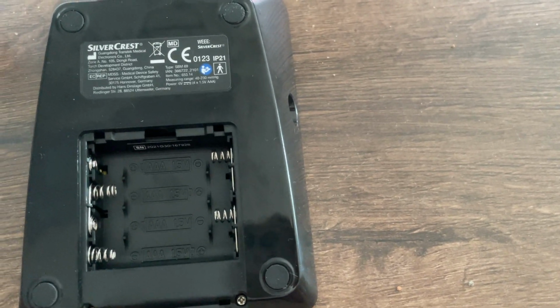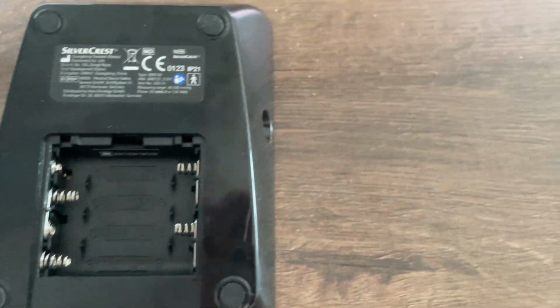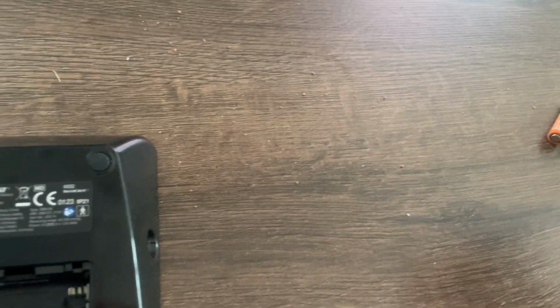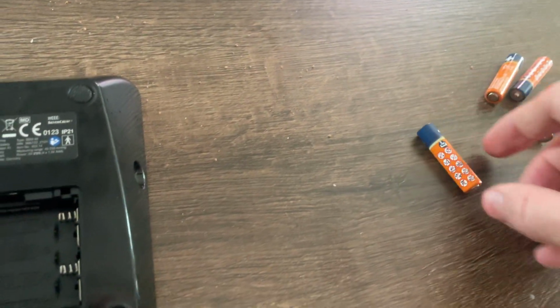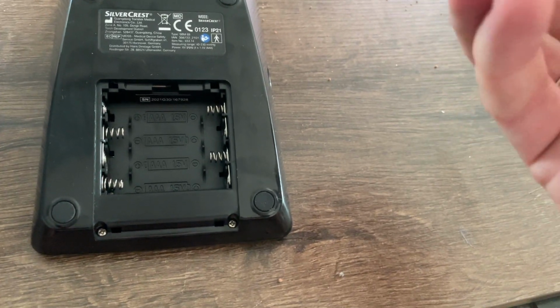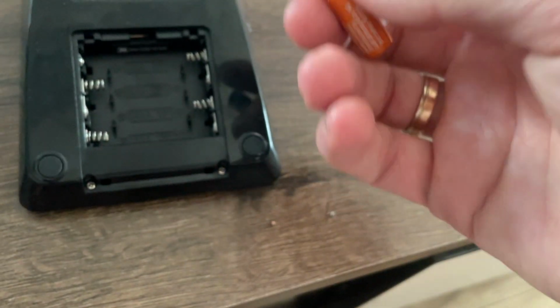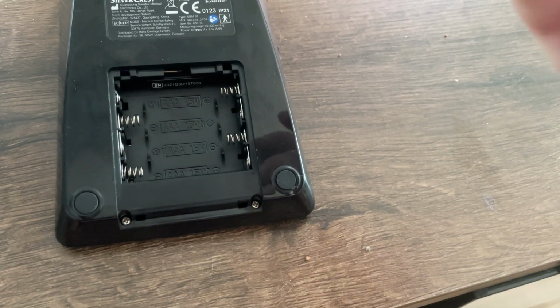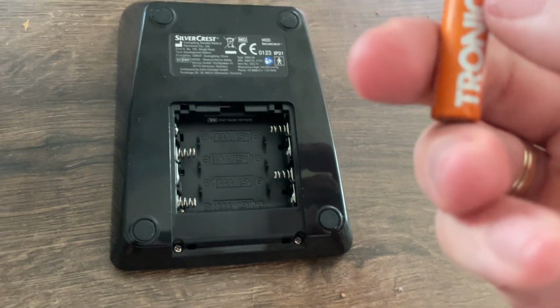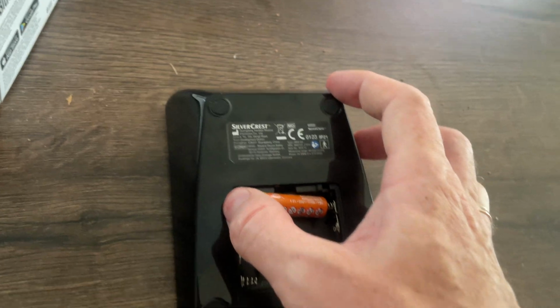Then when you buy the new ones, it's really crazy, but I bought the same batteries I have here, because I have a big package of these batteries, so you can put these batteries inside. It's very easy because you can see the spring, so the spring side is always minus, and on the other side is plus, so you can put them in really fast.